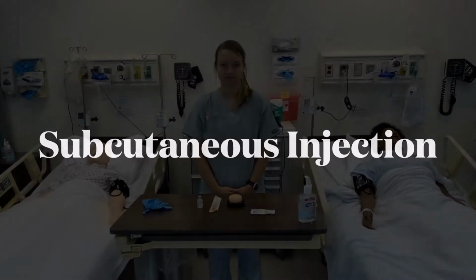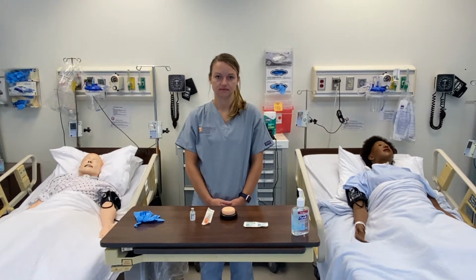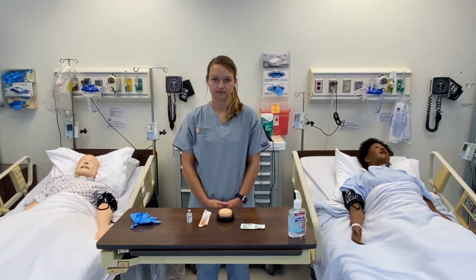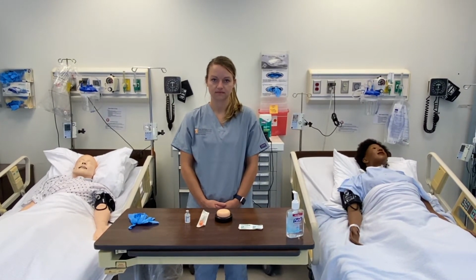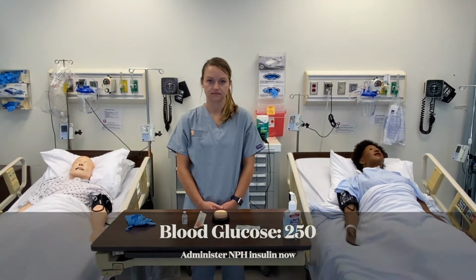This video demonstrates successfully administering a subcutaneous injection. Your patient is receiving sliding scale insulin to manage their glucose. You just performed a finger stick and the result was 250. Please give your patient their NPH insulin now.